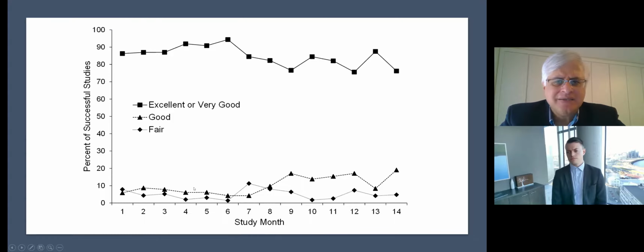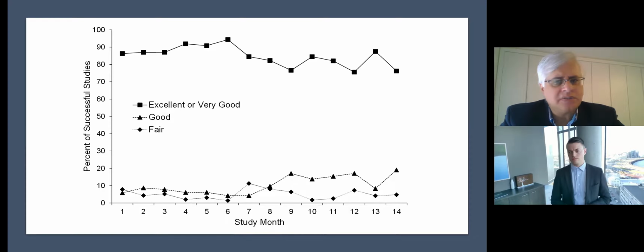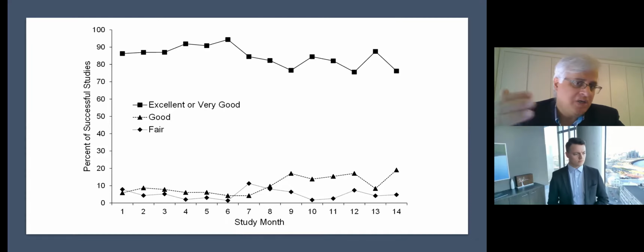And you can see some oscillation, but there wasn't really a learning trend or a deterioration over time in what we were doing. Again, I want to remind everybody that this is not a sleep lab. These are not trained technicians that know how to do this. I do wonder if we were to think about having trained individuals disperse this information or technology, what this could do.